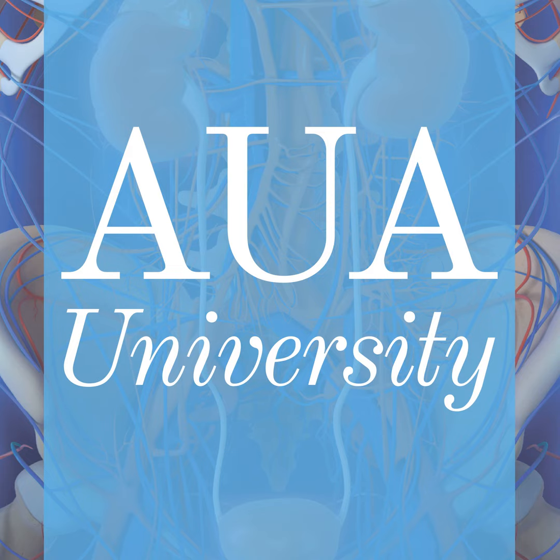And last but not least, we will give you some information on the application of new PSMA PET-based clinical staging systems, the PROMISE network, which is a very easy standardized interpretation of a PSMA PET scan. It's very objective, and it takes away the subjective interpretation of, let's say, some PSMA-avid lesion with low or high SUV values. That is the faculty.